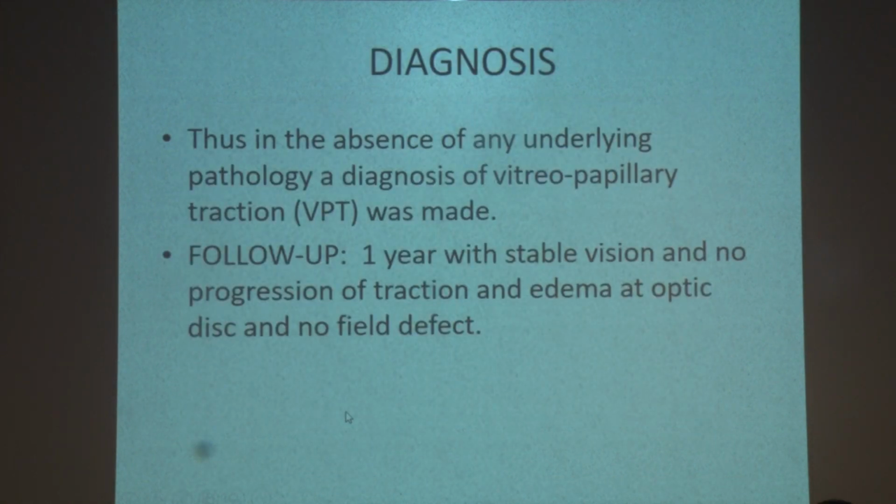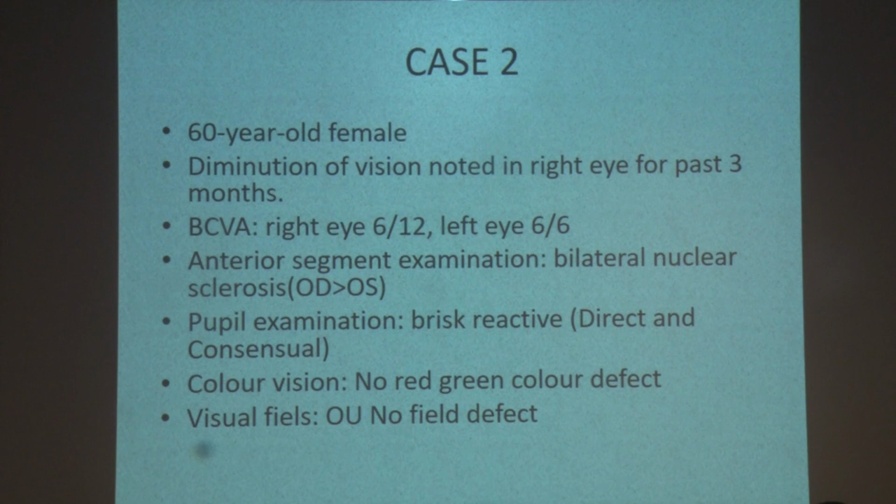So in the absence of any underlying organic pathology, a diagnosis of vitreopapillary traction was made, and the patient was followed up over 1 year with stable vision and no progression of traction and edema of the optic disc, and no visual field defect was developed.